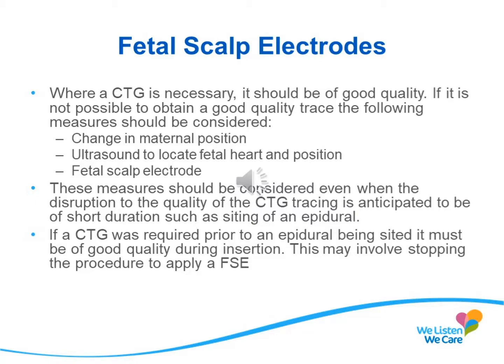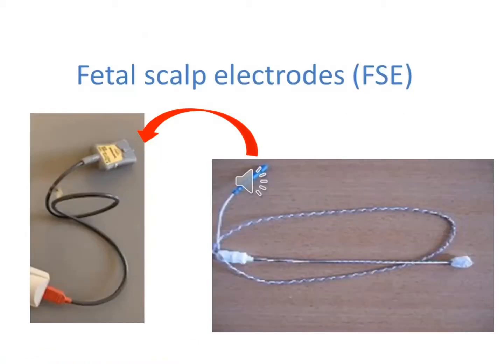If despite these measures you're still unable to obtain a good quality CTG, this should be escalated promptly to the coordinating midwife or one of the doctors. These slides show the fetal scalp electrodes that are currently in use at NUH.